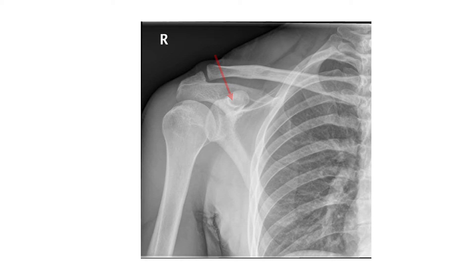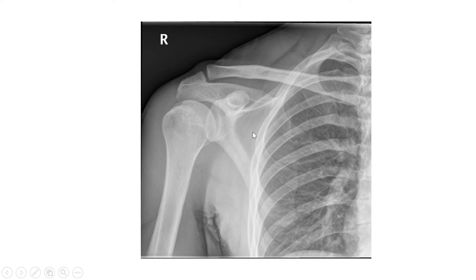This one is the coracoid process of the scapula. This is the acromion process of the scapula, which articulates with the acromial end of the clavicle and forms the acromioclavicular joint, which is a plane variety of synovial joint. This is the total view of the scapula — this is the body of the scapula, and the scapula is an irregular flat bone.